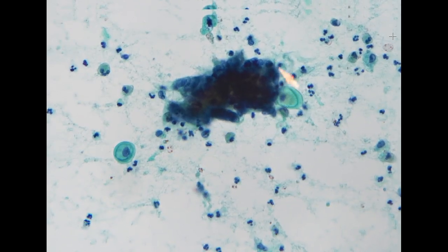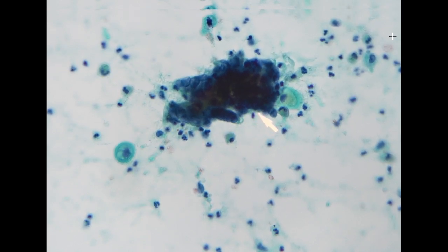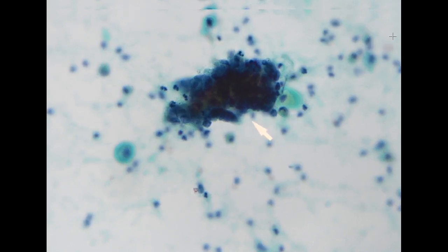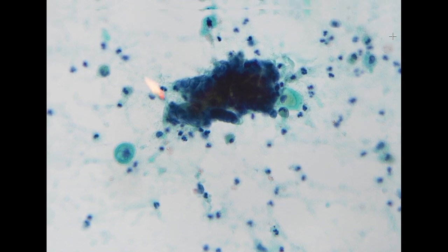But the problem is that these are very tight, hyperchromatic, crowded groups. They do have a peripheral palisading arrangement, suggesting that it is more like glandular cells. So these look like degenerated glandular cells with hyperchromasia and a crowded arrangement.